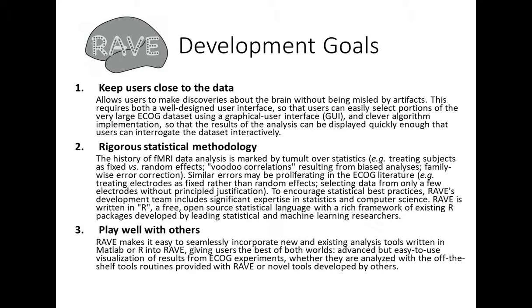And the final goal of RAVE development is to make sure that it plays well with others. That is to say that it allows you to work with existing tools that you might have in MATLAB or C or Python and integrate it into your existing processing pipeline so that you don't have to give up all the tools that you already know and love.